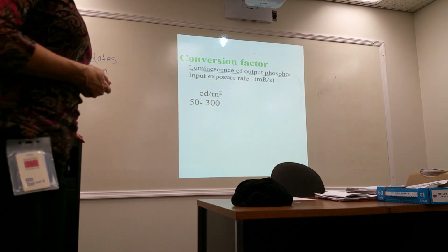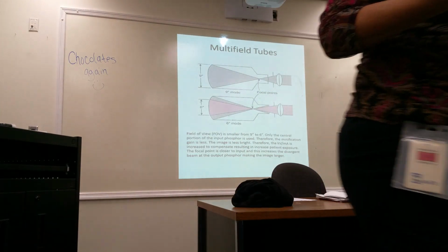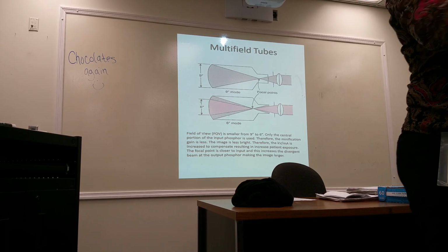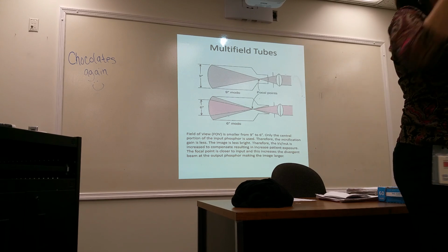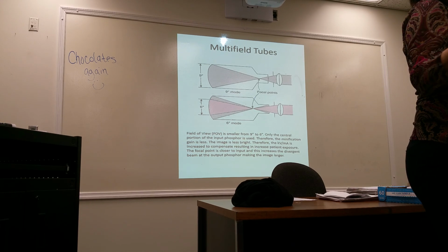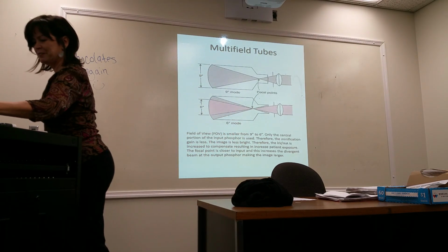Okay. Multi-field tubes. As I mentioned before, all the fluoroscopy tubes in your hospitals are probably multi-field, so they can be dual focus or trifocus, meaning they have the normal mode and then 2 mag modes. Normal mode and 2 magnification modes are typical. So here's what happens.